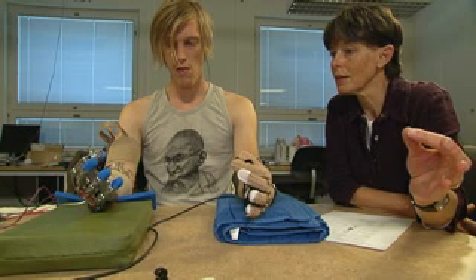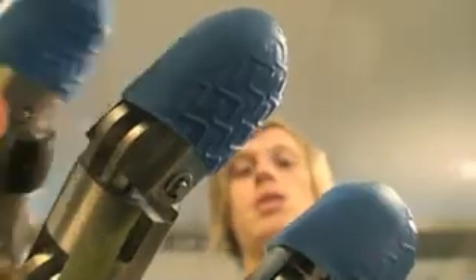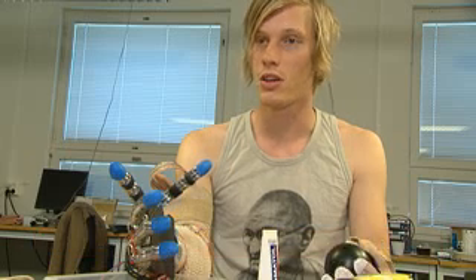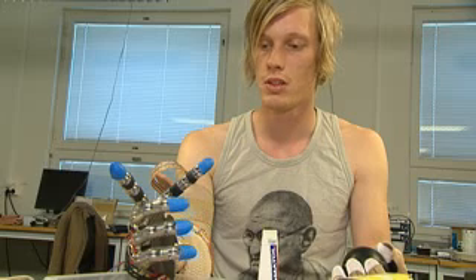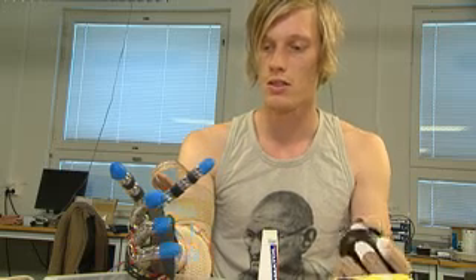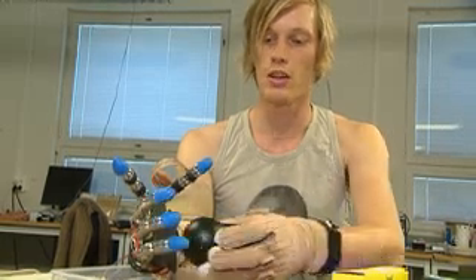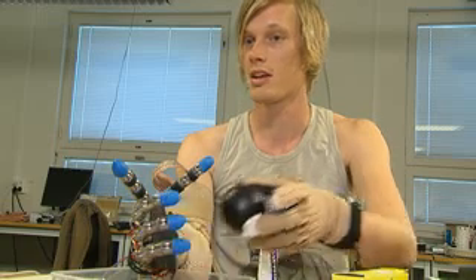This prototype restores feeling to the amputee when using an artificial hand. I have to use some muscles which I have not activated for years — that is very hard. But if you are able to control a movement, it's great. It's a feeling that I have not had for a long time. When I grab something tightly, I can feel it in the fingertips, which is strange as I don't have them anymore. It's amazing.